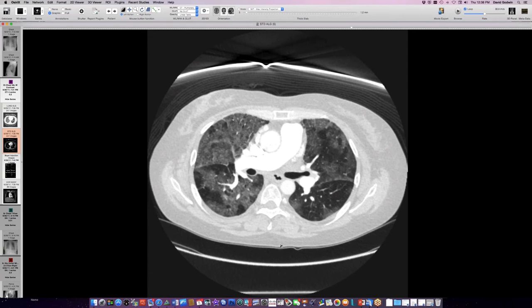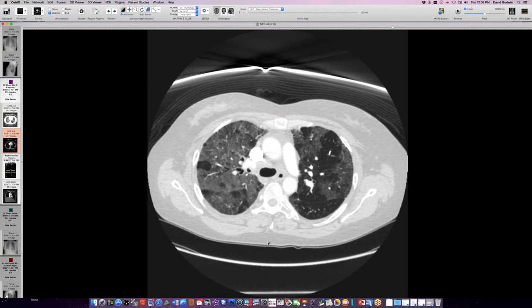She got better. At the time of the second chest radiograph, although the radiograph looked worse, she was actually feeling better, and she was discharged yesterday. So pretty dramatic case of presumptive, I think strongly presumptive, fat embolism syndrome. And I asked our trauma radiologists at Harborview whether they see this commonly, and I was surprised to hear that they don't see it despite the huge volume of trauma that they see. So fat embolism, I think, is not diagnosed as frequently as I would have expected from all that trauma, or maybe it's mistaken for other causes of ARDS, given that there's trauma and that can precipitate ARDS.